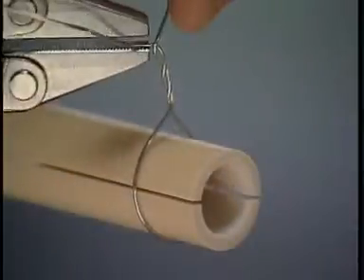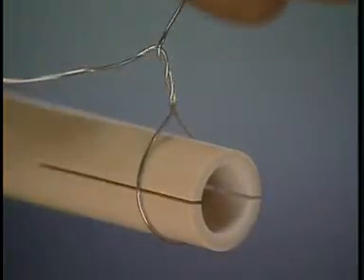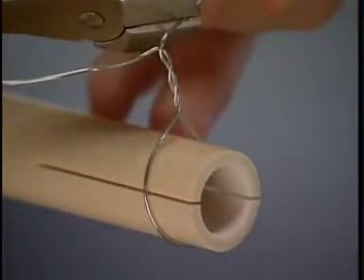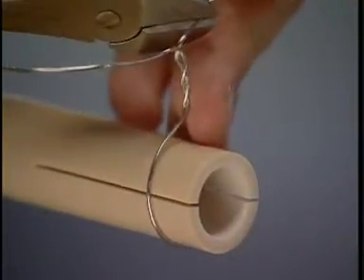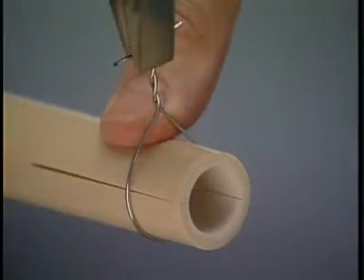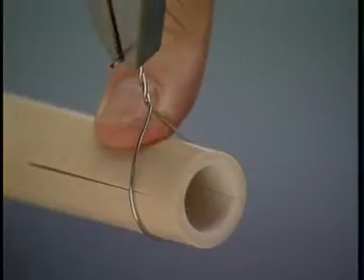The two free ends of the wire are bent 90 degrees and held securely while excess wire ends are cut off. The thumb is used to help keep the wire 90 degrees to the long axis of the bone. In surgery, an instrument would be used for this purpose. The wire is twisted with even tension applied until it engages the bone.